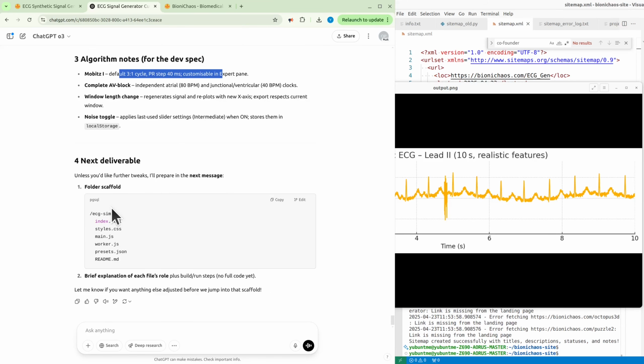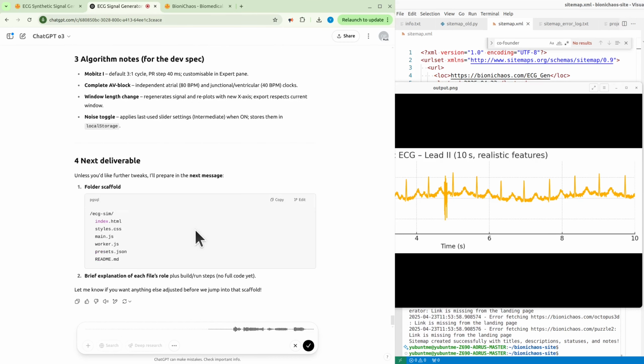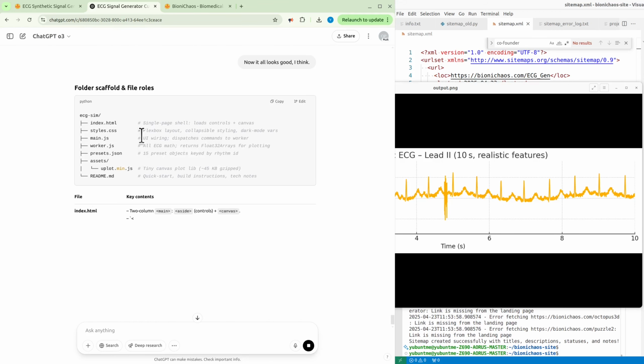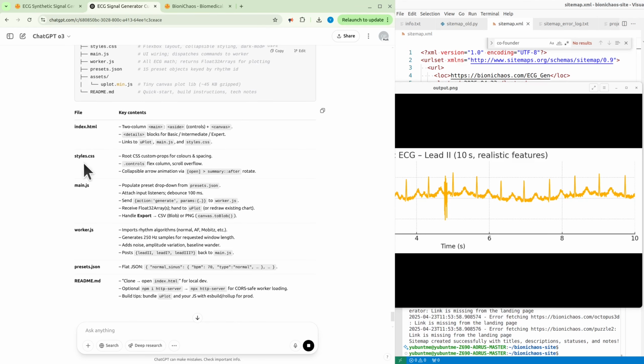Okay, so I have a project structure. Where's the explanation for each file? Well, they should be straightforward, except the split for the two JSON files. Now it all looks good. I think just keep going with all three. Later, if we have the whole description of the web application, we can try other models for generating the code, and also GitHub Copilot as well.